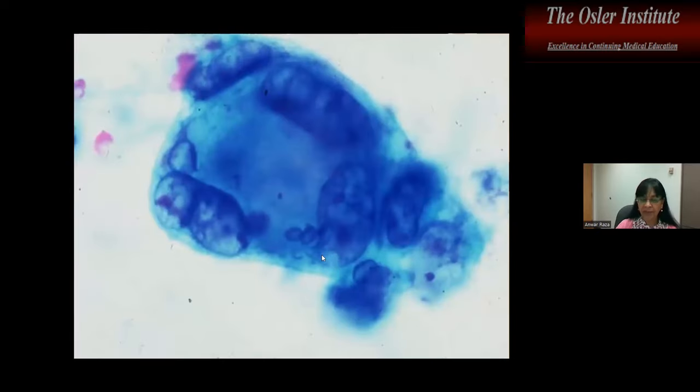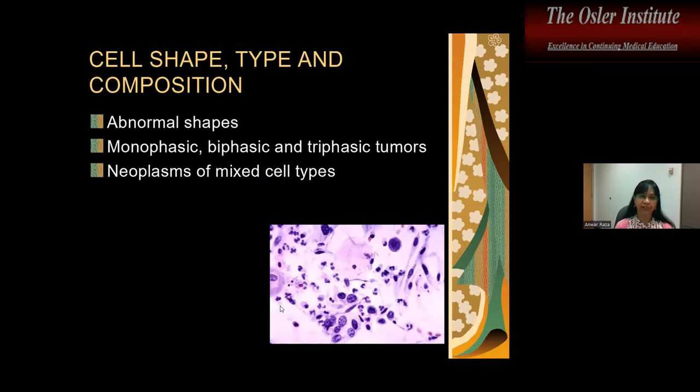And this is another multinucleated giant cell, but this is an example of a tumor giant cell. So in malignancy, notice the nuclear membrane is irregularly thickened, right? So that's something that's going on. The chromatin is irregular. You have marked pleomorphism. So that is an example of a tumor giant cell.